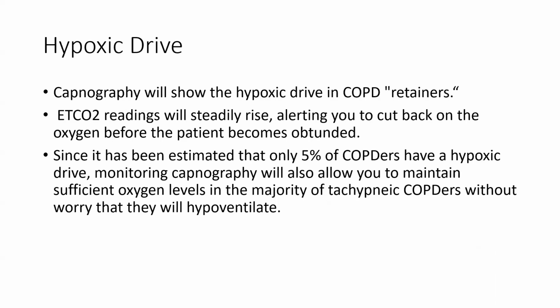Now, about hypoxic drive. Capnography will show hypoxic drive in COPD. The EtCO2 reading will steadily rise, alerting you to cut back on the oxygen before the patient becomes obtunded. Since it has been estimated that only 5% of COPD patients have hypoxic drive, monitoring capnography allows you to safely give oxygen in the majority of tachypneic COPD patients.